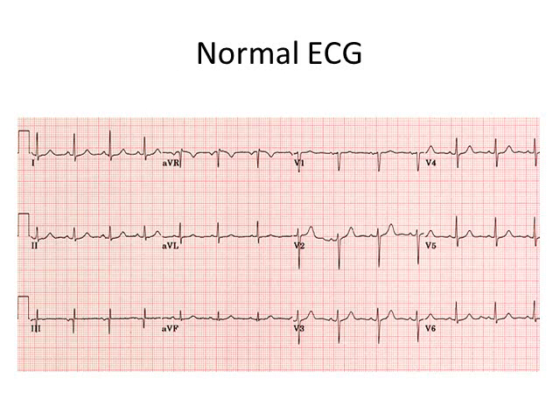And that's just a normal ECG. And the more normal ECGs you see, it's the same as anything in medicine, the more obvious it is when you get an abnormal. So just get used to this trace.